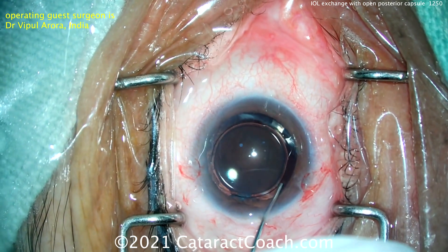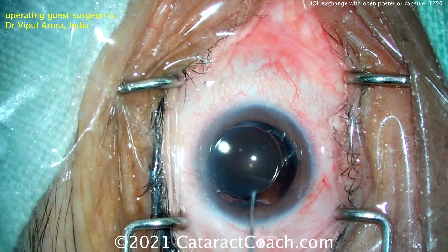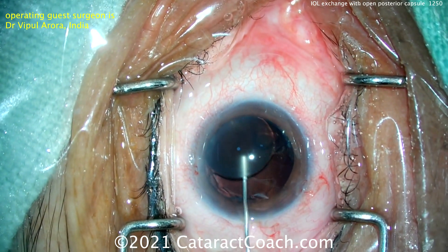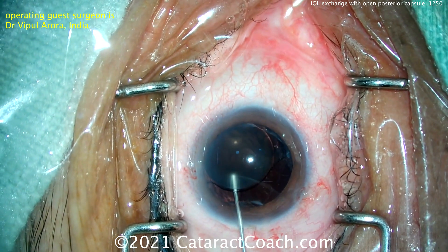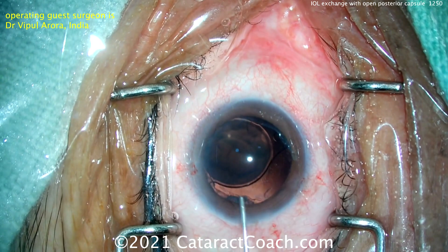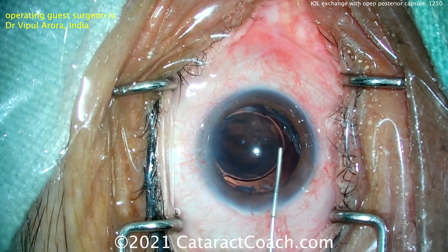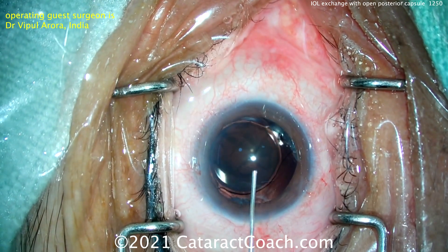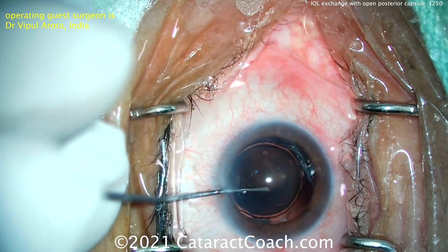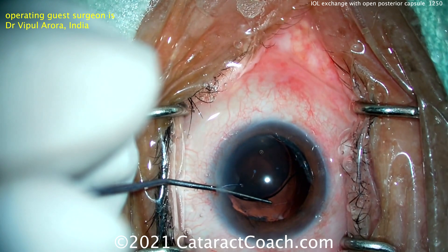Getting viscoelastic — visco-dissect. Remember, viscoelastic is cheaper than vitreous. Disperse the viscoelastic going underneath it and get that lens up and out of the way. The haptics are now horizontal on your screen — at the patient's 12 to 6 o'clock position because the surgeon is sitting temporally. A lot of viscoelastic going inside the eye here, to tamponade that hole in the posterior capsule.